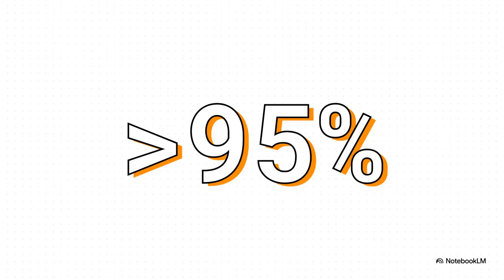Second, the performance benchmark. You've got to show an intra-observer concordance rate of over 95%. What does that mean? It means the exact same pathologist, looking at the exact same case, comes to the same diagnosis on both the glass slide and the digital image more than 95% of the time.